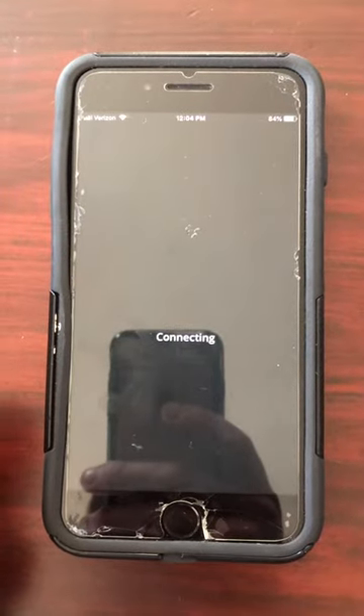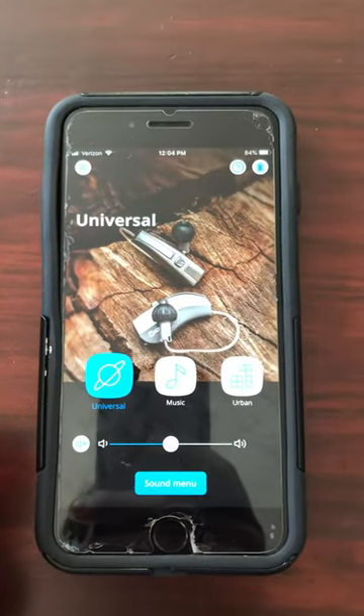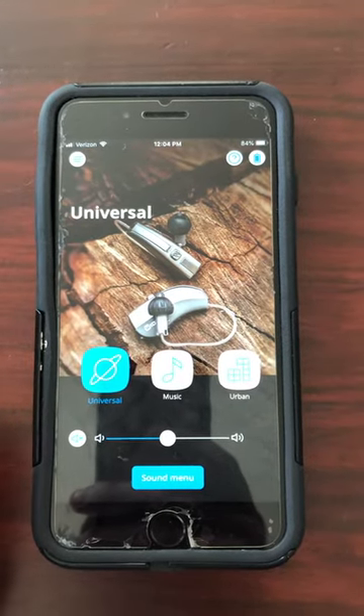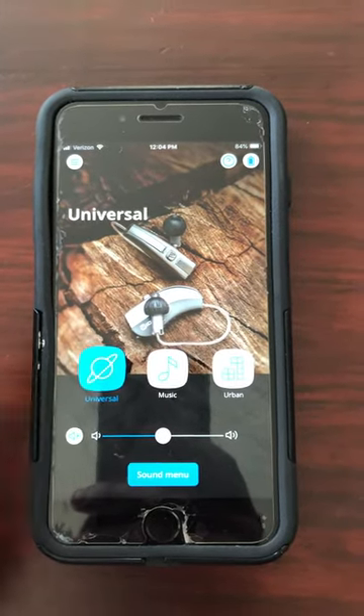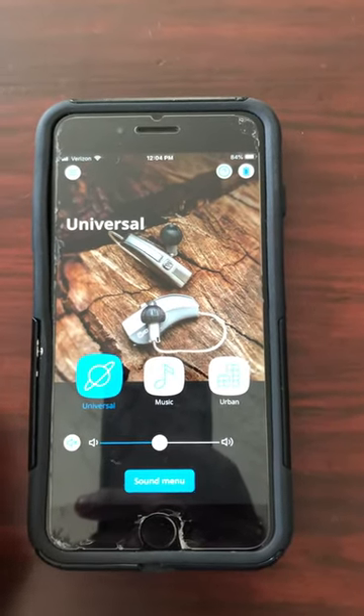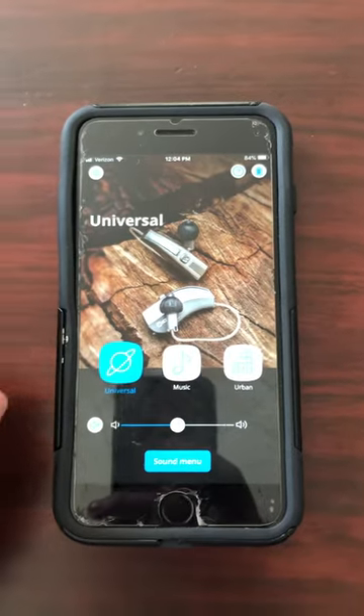Go ahead and open the app — it's going to connect to your hearing aids. The home screen will be this. The very first time you access the app after you've installed the TV Play, you will see a prompt on the screen that says 'TV Play has been added.' So that's another indicator that the TV Play has been successfully added.